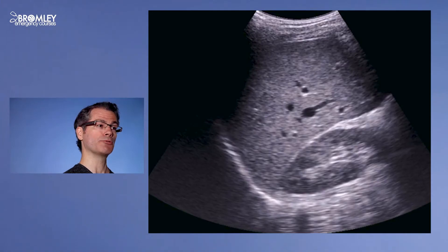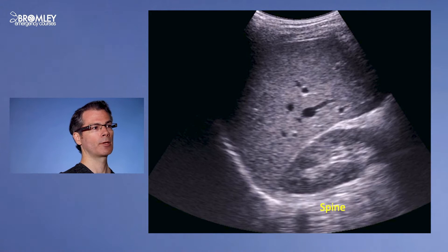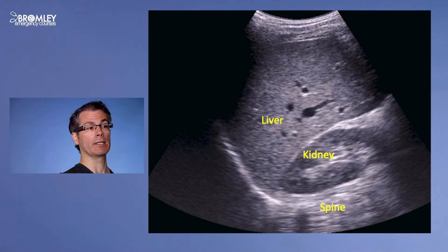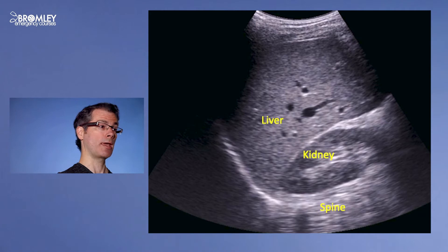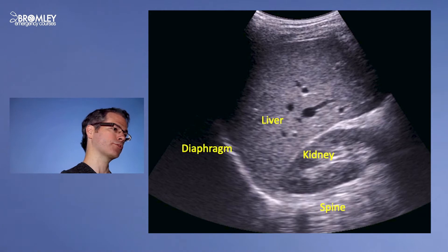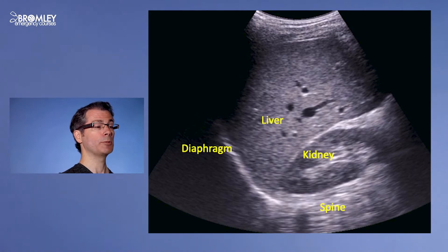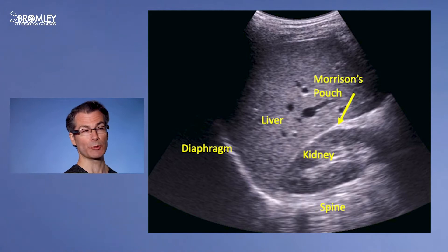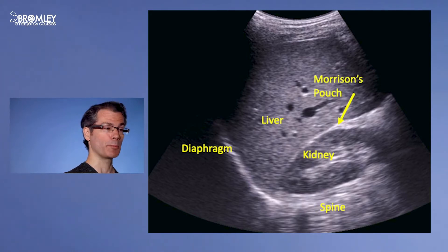Here's an image of a normal right upper quadrant. At the back of the image is the spine, at the front is the liver, and in between is the kidney. To the patient's head, to the left of screen, is the diaphragm. And in between the liver and the kidney is the potential space, which we call Morrison's pouch.